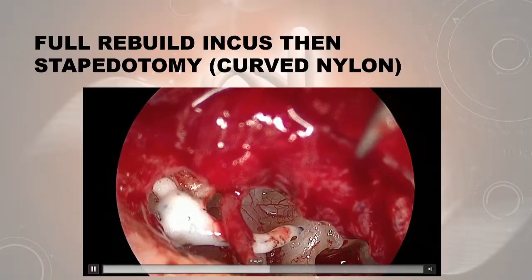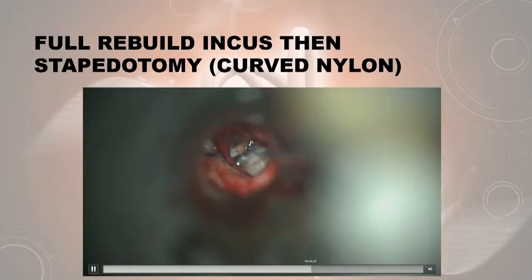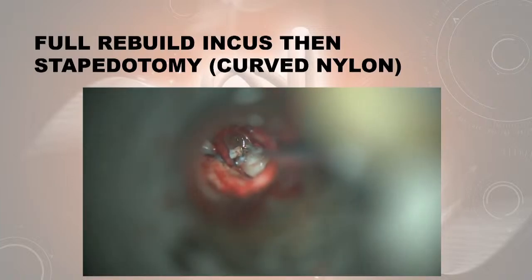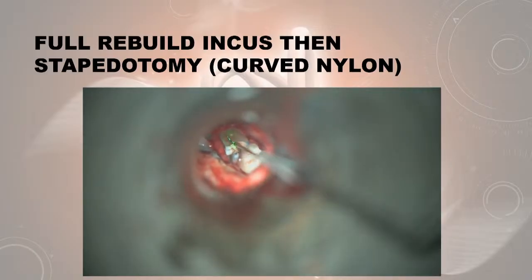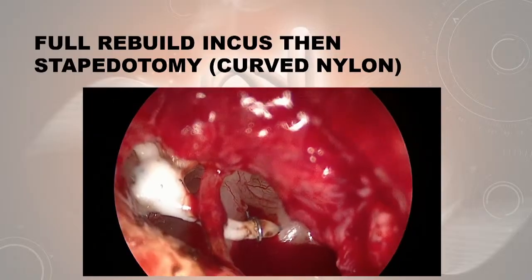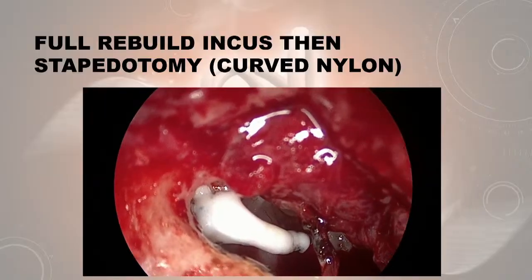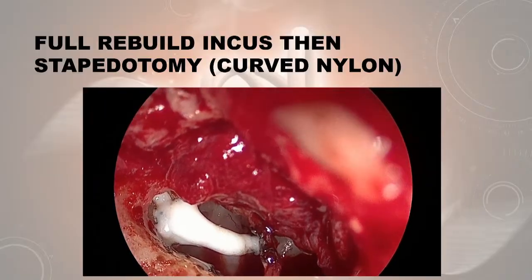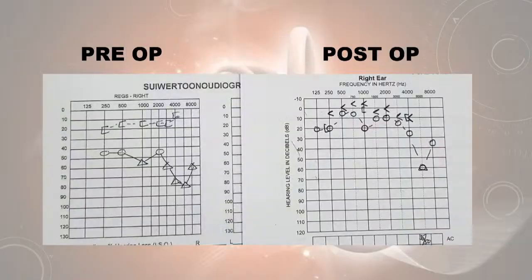So then I was happy to go and drill on the stapes footplate. Drilled in the stapes footplate. Sorry, the one's an endoscopic view, the other's the microscope view. And while I was lasering the piston, it cracked. You'll see now. It suddenly cracked, so obviously it was weak, not strong enough in terms of the cement, but it's perfectly in place, and I just reinforced with a little bit more cement afterwards, and that patient's doing fine so far. All right. That was a nice result there as well.